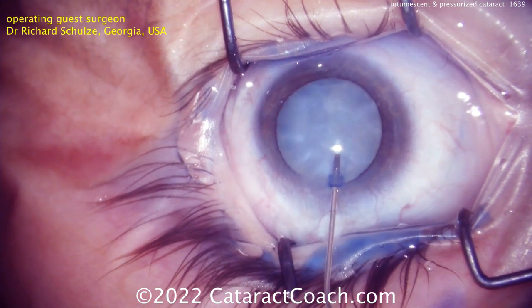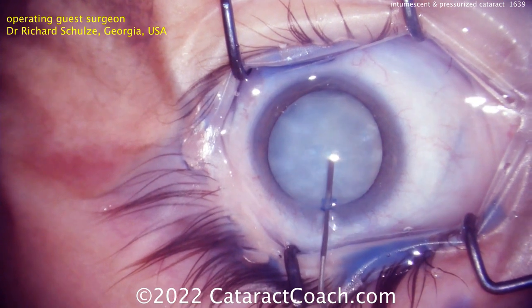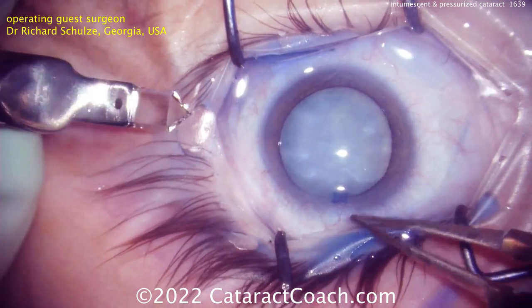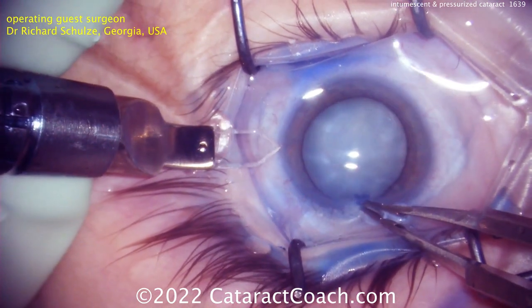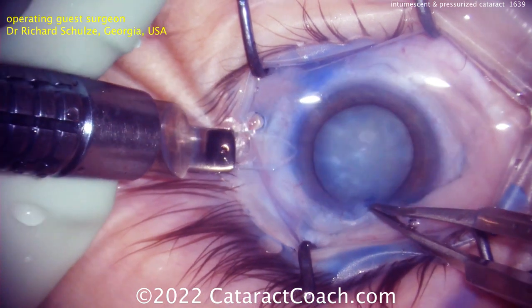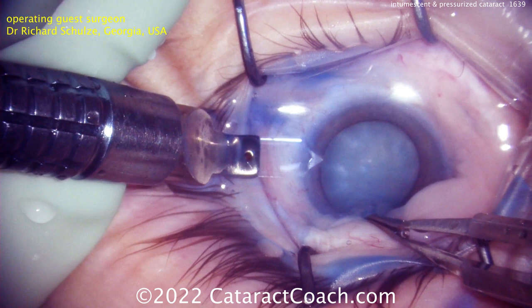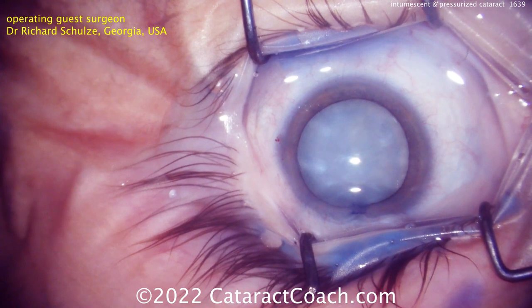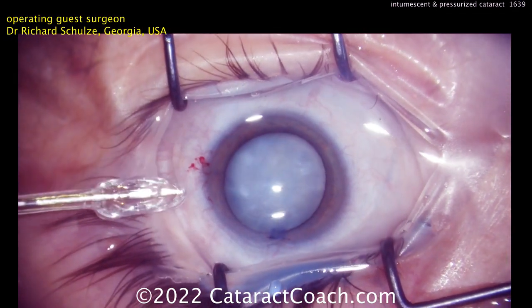This capsular bag is so highly pressurized that if you try to stab in with a needle for decompression, it's going to rip the capsule uncontrollably — we've shown videos of this on Cataract Coach before. Instead, the Zepto device will be used here. The surgeon is sitting superiorly, making a temporal incision with a diamond keratome, and now the Zepto device is coming in.